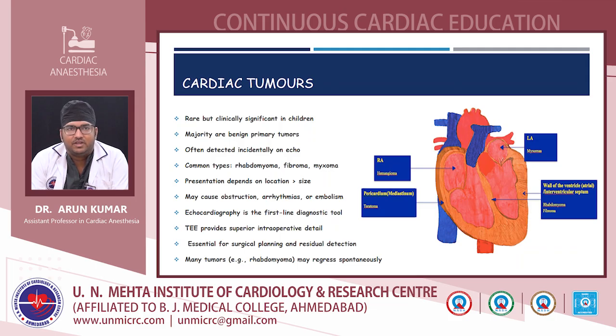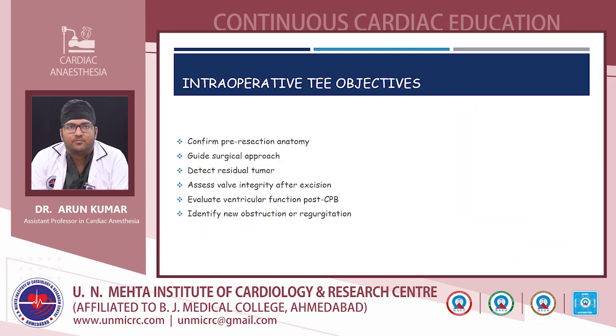TEE provides superior imaging in intraoperative scenarios, and it is also essential for surgical planning and detecting any residual abnormalities after excision. Also, one important point is that many pediatric tumors may regress spontaneously. Mostly the surgical decision would be because of the mass effects of the tumor.